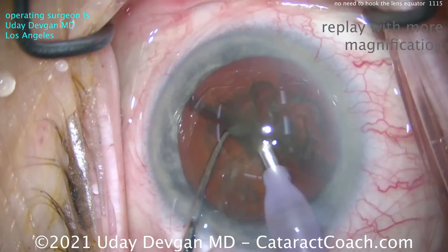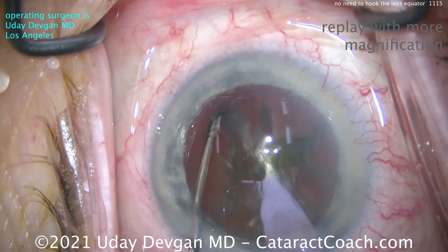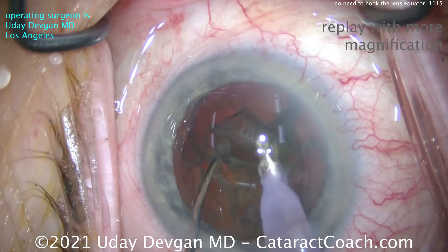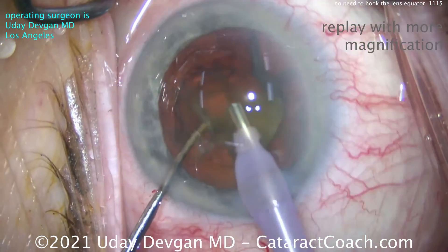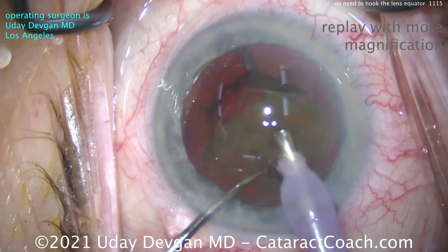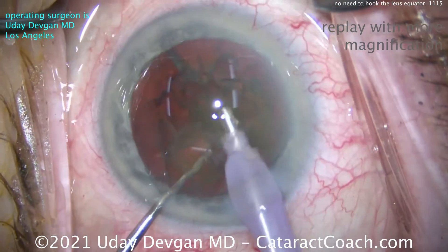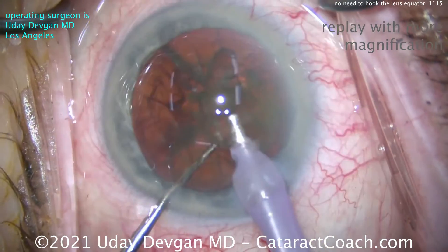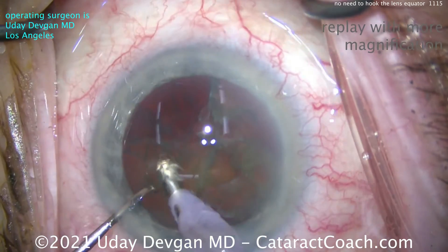Resuming at normal speed, it's very easy to do this technique again — pushing the chopper right into the nucleus, split that, and there we go: quadrants. This is a repeat with higher magnification. Notice how the chopper at this point just pushes the pieces in front of the probe, keeping them in the correct position.